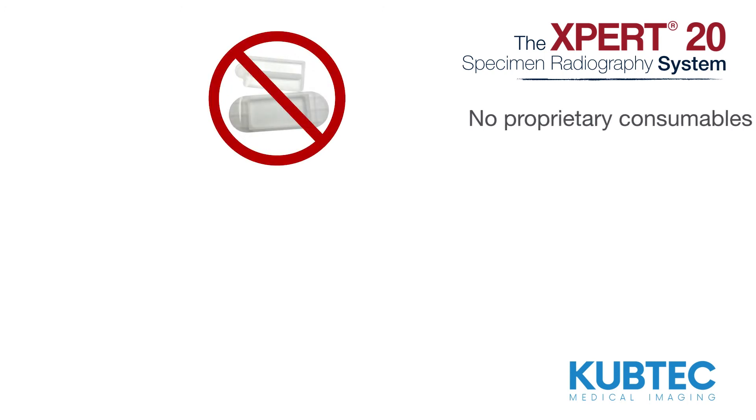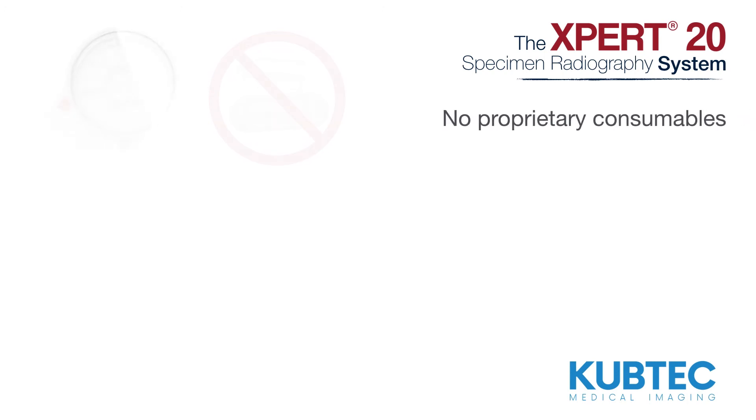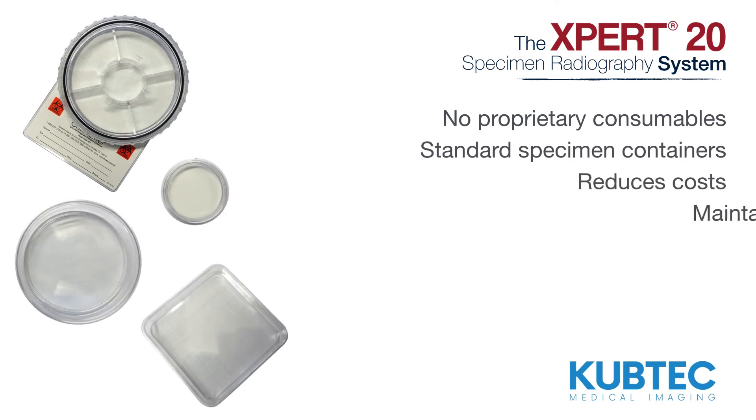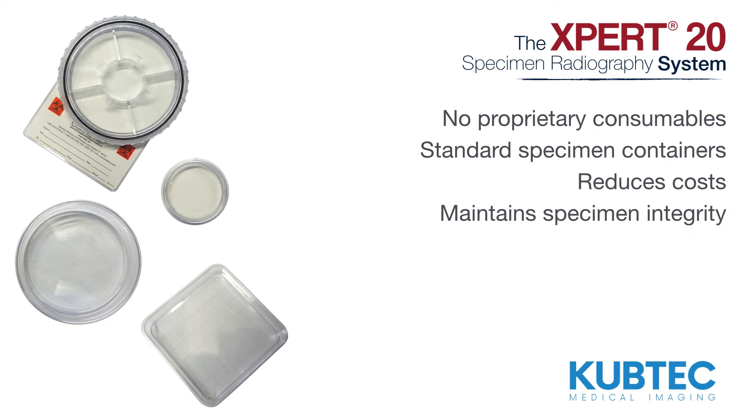The Expert20 system uses no proprietary consumables. Instead, you can use standard specimen containers, reducing cost and helping maintain specimen integrity for pathology.